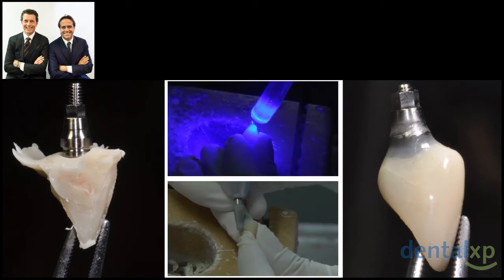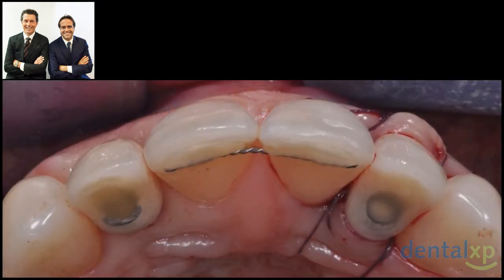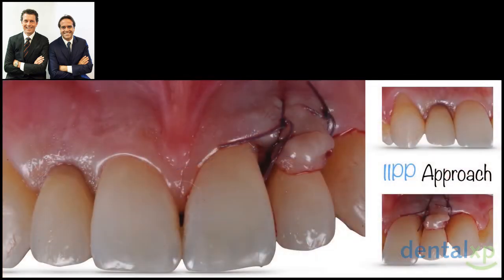And here we have the same occlusal picture at the end of the prosthetic procedure as well, and you can see that the two sides, which as I said are different, also look different, because on one side a guided bone regeneration was done to recreate this root profile, and the soft tissue was split buccally in order to give this anatomy, while on number 12 or number 7 nothing was done, only placing the implant without opening any flap, and then on top of it placing the provisional restoration. The provisional restorations in place. This image will explain the two different scenarios.